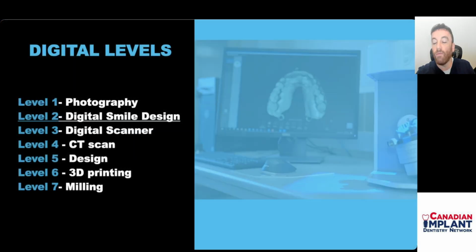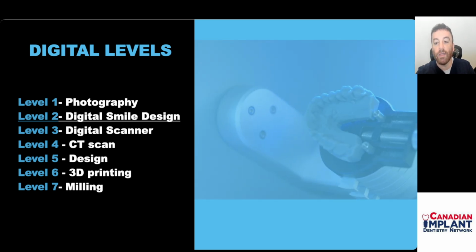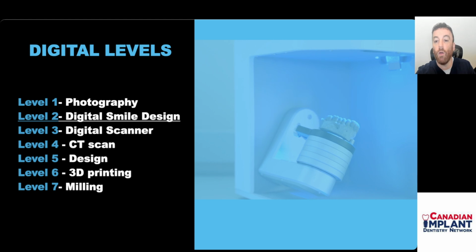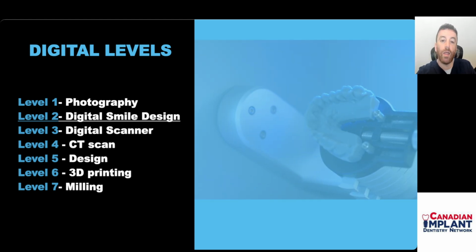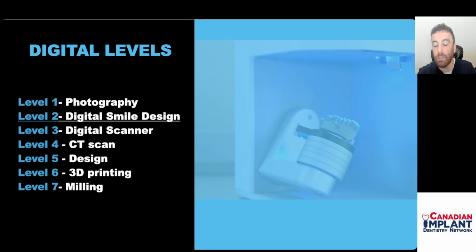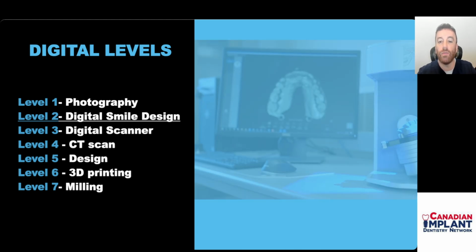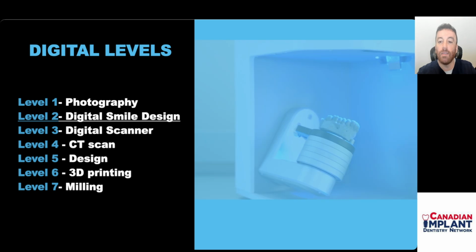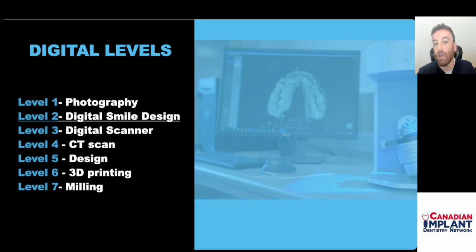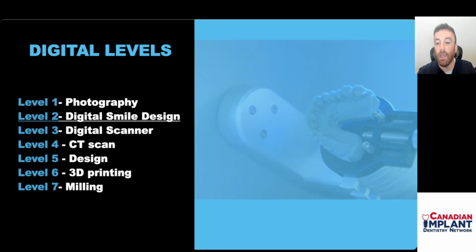I think a big part of that is digital dentistry, because digital levels can be overwhelming for a clinician who's confused on where to start off. So I always recommend to clinicians to begin with high-end photographs of their cases. Why? Because that will dictate your treatment planning in terms of smile aesthetics, in terms of transition zone, and hopefully having a favorable outcome.